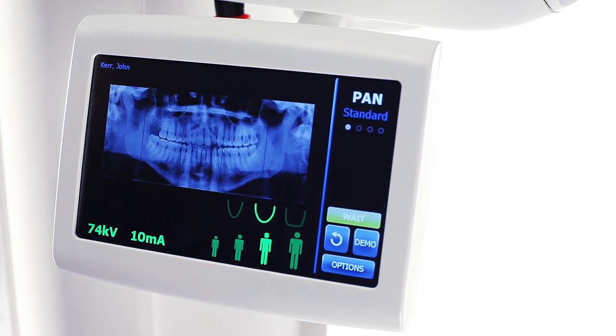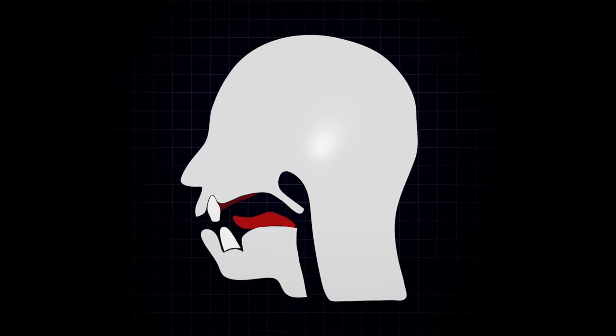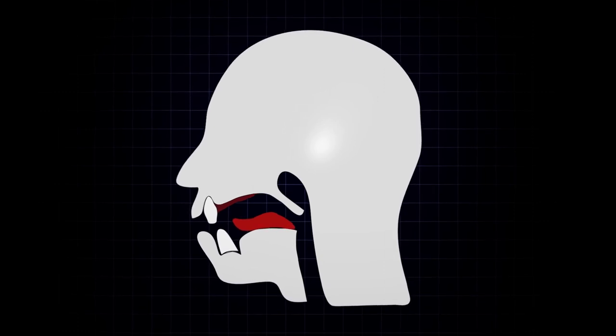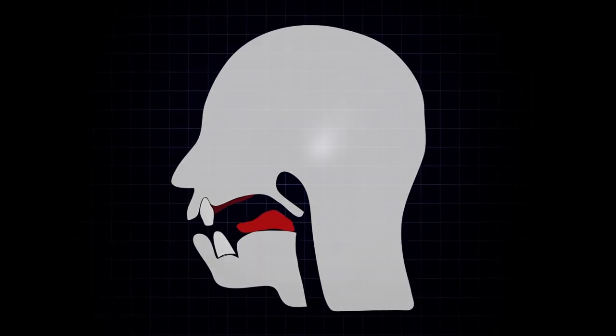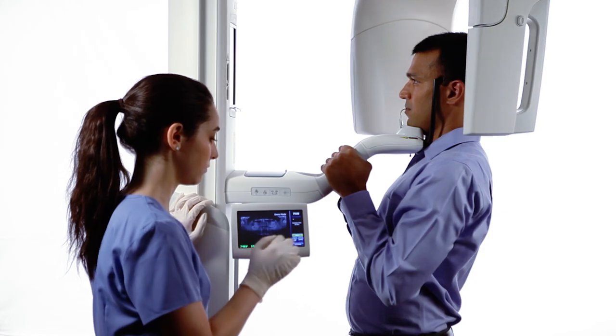On the control panel, tap the cycle button once and verify the green ready condition. Instruct the patient to place the base of the tongue to the roof of the mouth as if swallowing. Ask the patient to remain still and hold their breath for the duration of the scan.